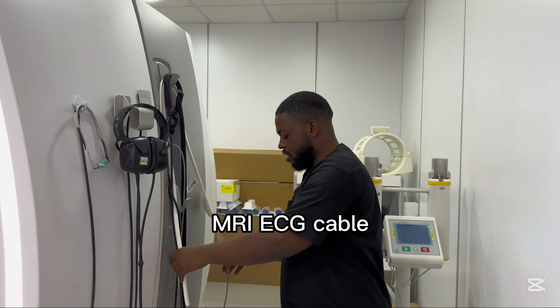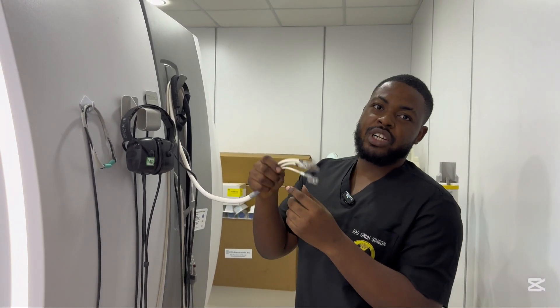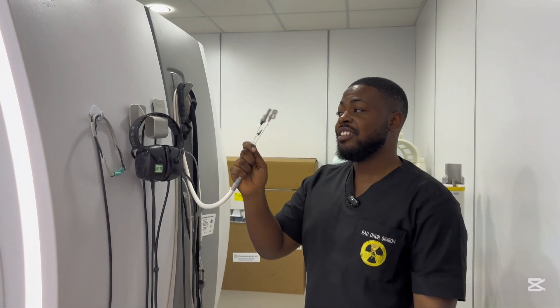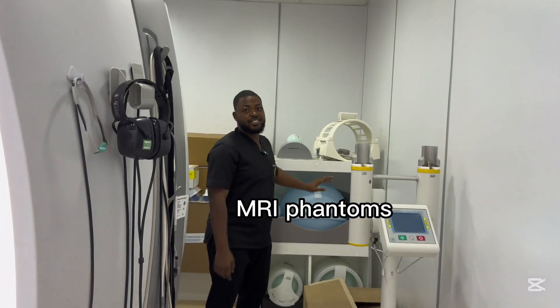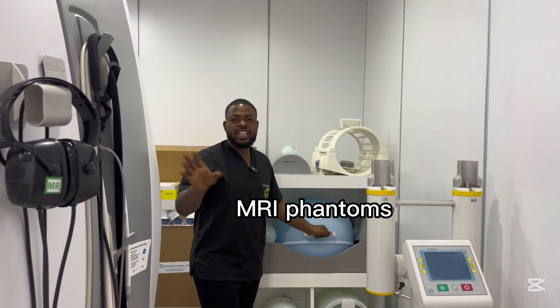These are ECG plugs — we use them for cardiac examinations on the chest. And these are MRI phantoms of varying sizes; we use them to warm up or carry out calibration examinations.